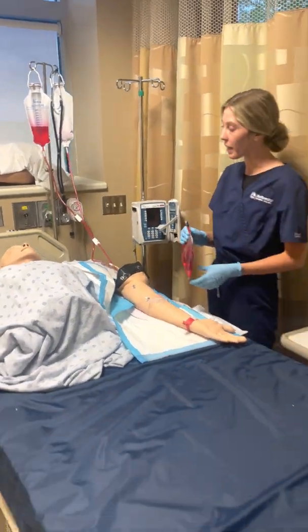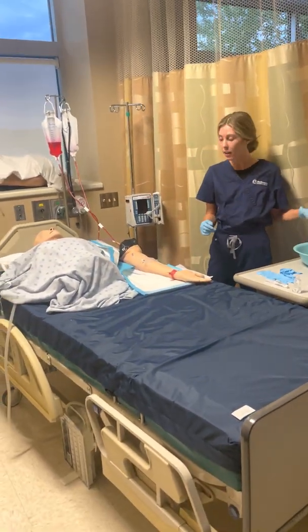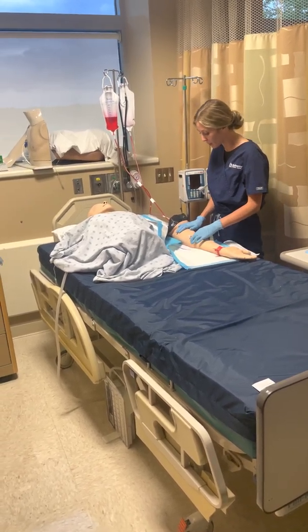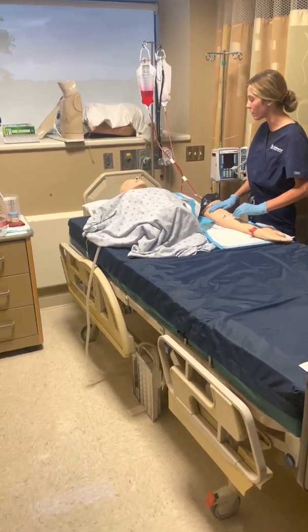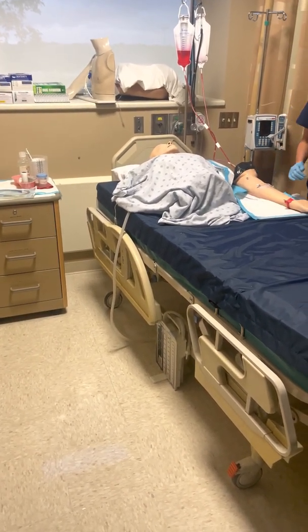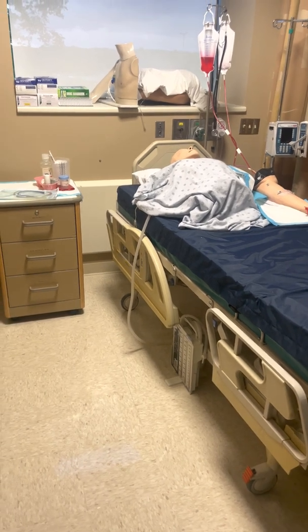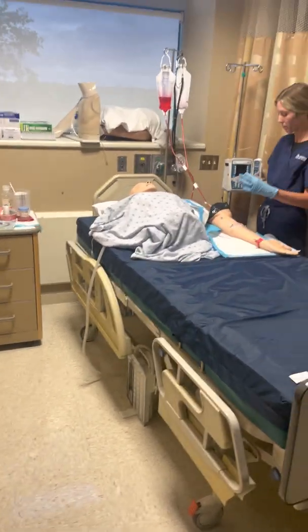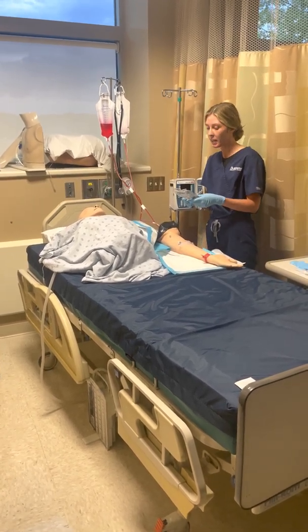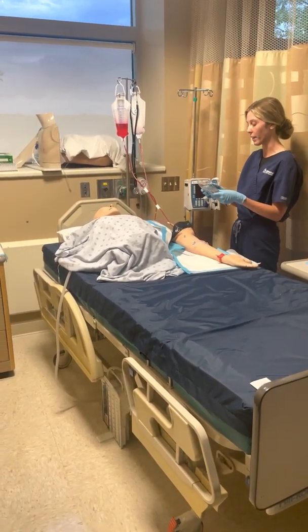All right, Betty, so again, if you feel like you have any shortness of breath, headache, chest pain, side pain, back pain, or abdominal pain, please bring it to my attention right away, and we'll immediately stop the transfusion process, and we'll bring the doctor in here, okay? So along with the blood, we are going to run some normal saline today with the blood. This is important to run with the blood, and it is important that it's just normal saline, not lactated ringers or dextrose solution.